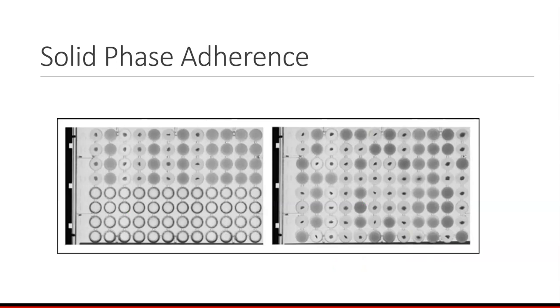This slide illustrates 2 panels with positive and negative reactions. Now remember, the solid buttons are negative because the antigens or antibodies are coated to the sides of the wells and will react with the patient sample if that reaction has occurred. If you look to the second row where there's a solid mat on the bottom, that is a positive reaction.